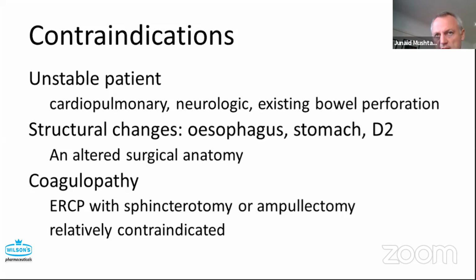And these are cases that really do need to be carefully thought through or done in an advanced center. On one occasion, we were able to get through the esophageal cancer, and we do need to know the caliber of our scopes. For example, a standard duodenoscope may be up to 13 or 13.5 millimeters at the tip. So your caliber of your tumor or your distal fibrotic stricture in the esophagus needs to be addressed as such.